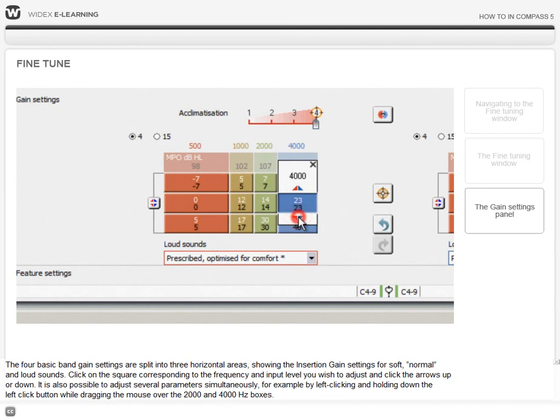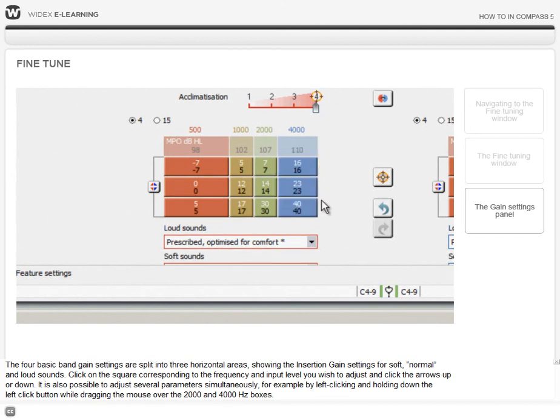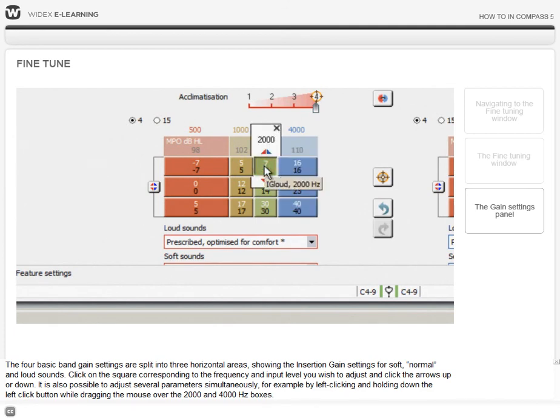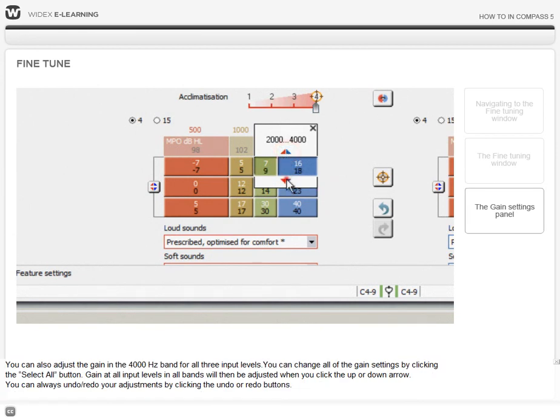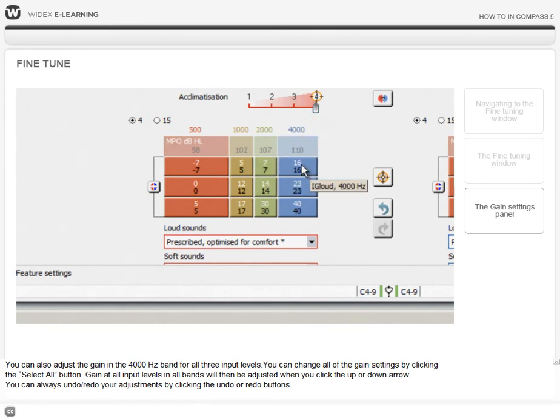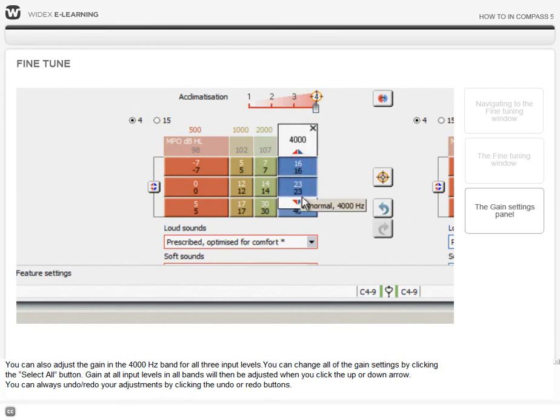It is also possible to adjust several parameters simultaneously, for example, by left-clicking and holding down the left-click button while dragging the mouse over the 2000 and 4000 Hz boxes. You can also adjust the gain in the 4000 Hz band for all three input levels.